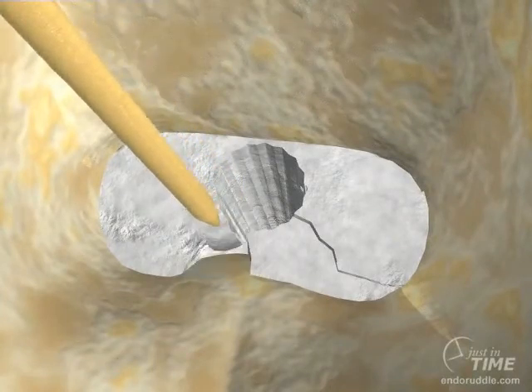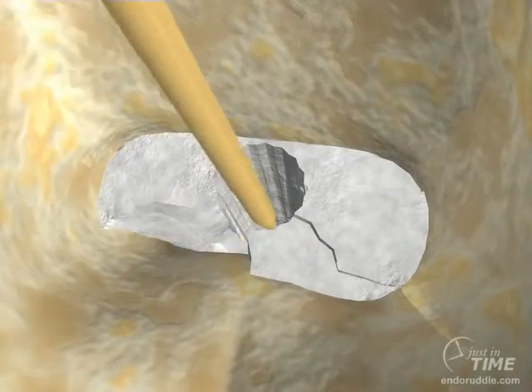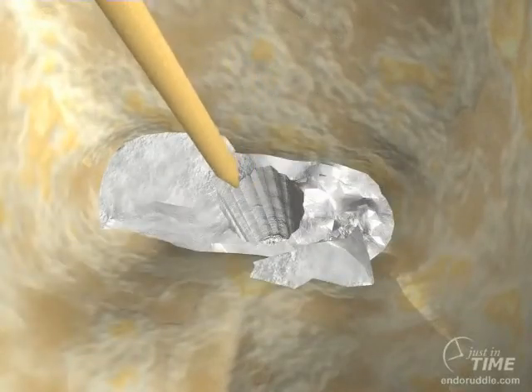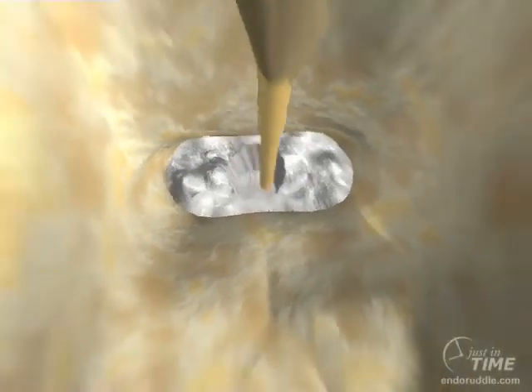Once the post is out, we can use a different Pro-Ultra instrument, like a number 3 or 4, to remove residual cements that were lateral to the post.